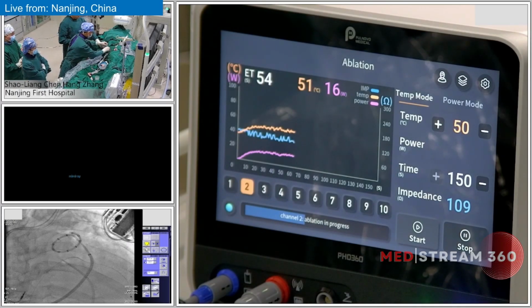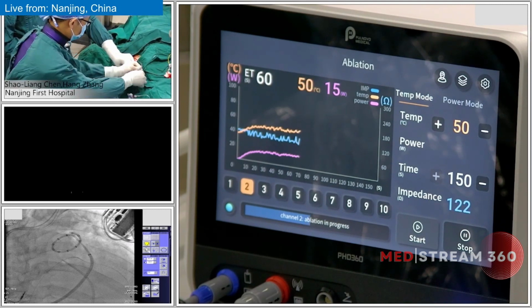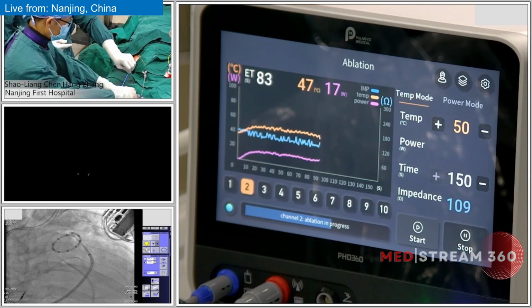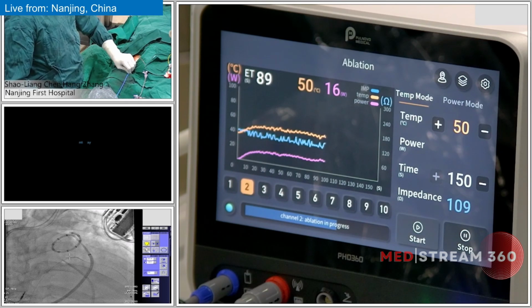So even though the lumen is pretty large, because the PADN catheter is almost 7.5 French, there is a very small space to measure pressure from the lumen, but we can try. Before the procedure, the mean pulmonary arterial pressure was 47. Okay, so let's see how much change of mean pulmonary arterial pressure. So right now the mean pressure is 38 to 39. It looks good. Looks good.